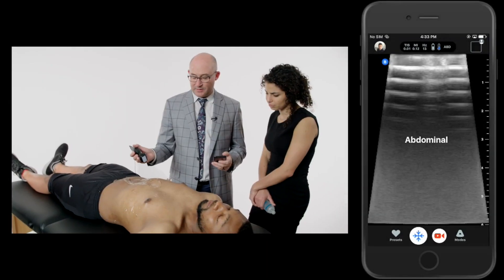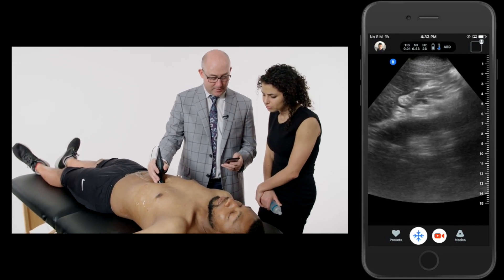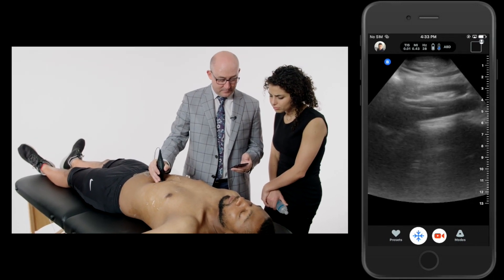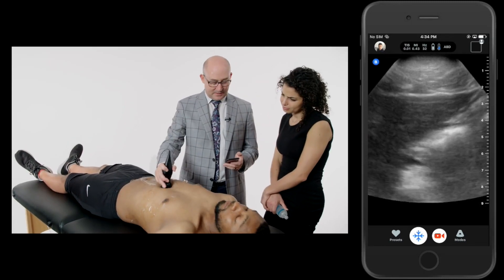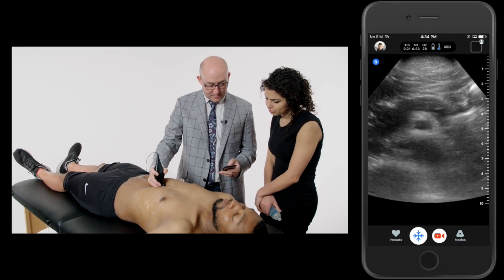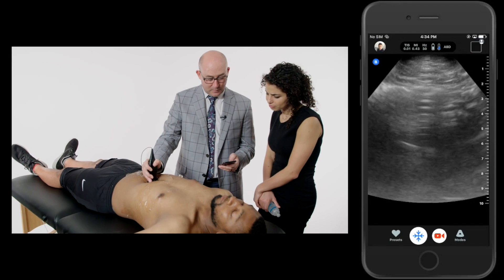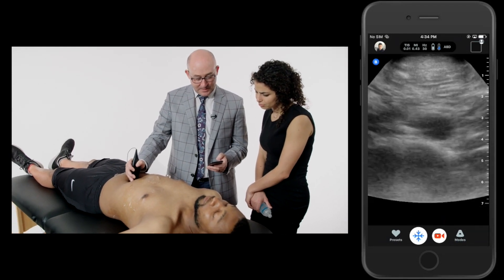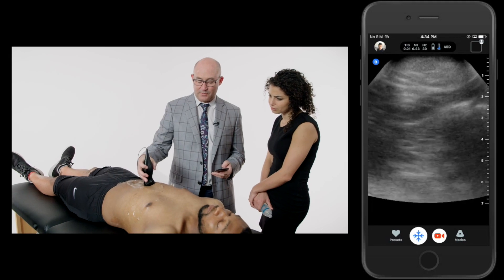We're just live scanning again. I'm going to select abdominal mode to look at his aorta. Here I am in a longitudinal view — there's his aorta stretching out across the screen right underneath his duodenum. As it comes down, we can see the whole tube lengthening out there. Decrease my depth as I go distally. Now we're looking at a transverse view of the aorta. I can see the spine shadow and the superior mesenteric artery on top of it. I'm just over a loop of bowel, so it goes away, but I come off that loop and I can see the aorta in the center of the screen. Decreasing my depth as the aorta gets more superficial distally — and boom, it just bifurcated.